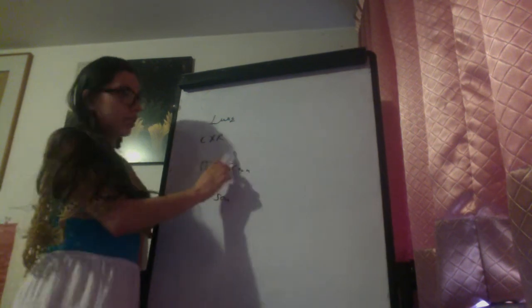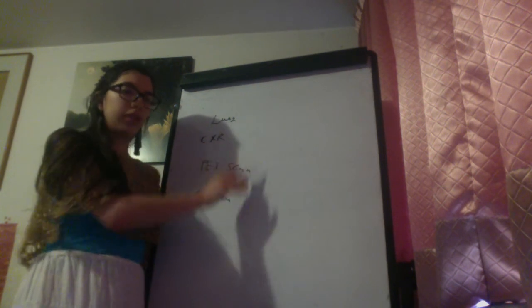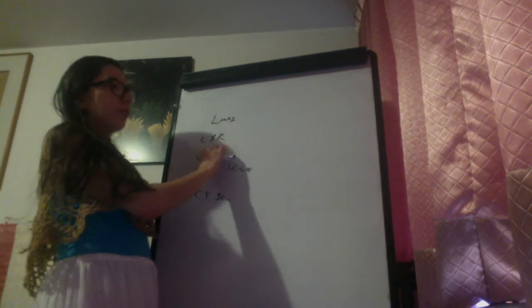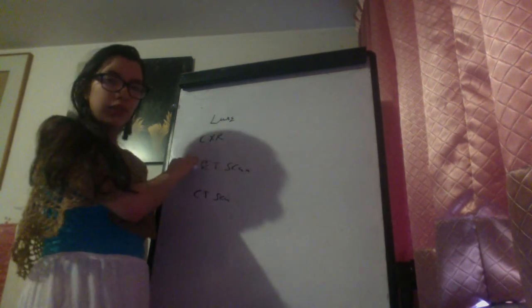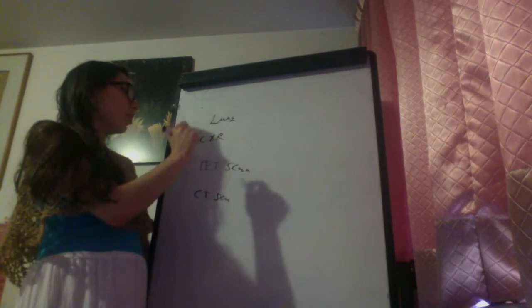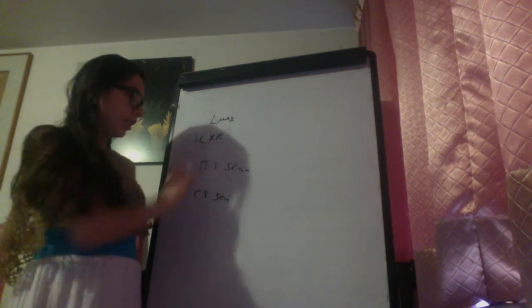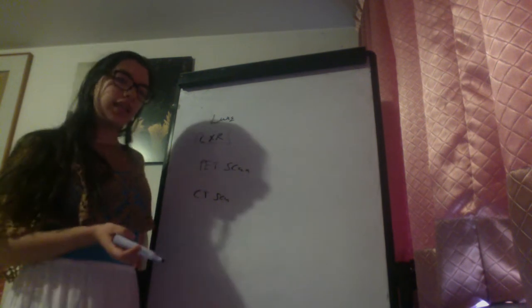The chest X-ray is the most common and usually is the first test that we do for every lung complaint or thing that we want to see, like some screening. For example, for lung cancer, sometimes we see signs of a disease before the symptoms arrive, and sometimes we can see things in the chest X-ray that would lead us to do another test. For example, if we see a solitary nodule or things like that, it depends.